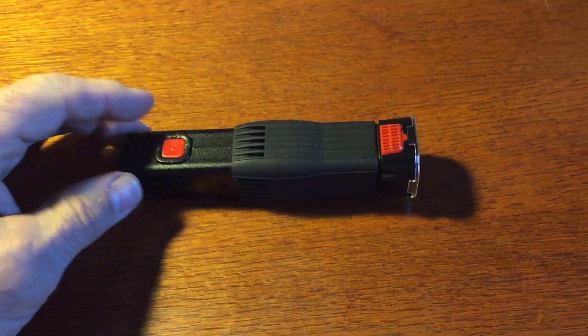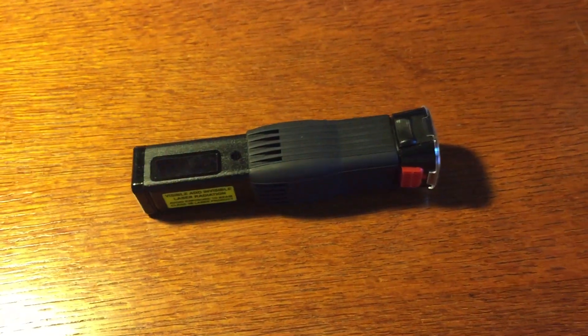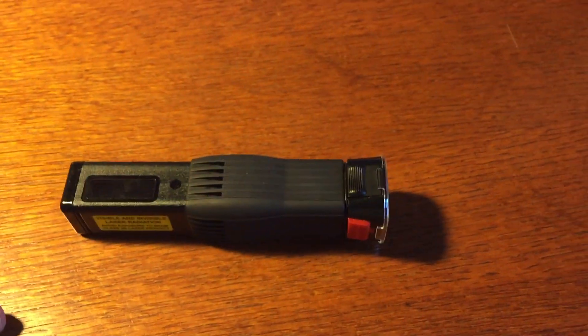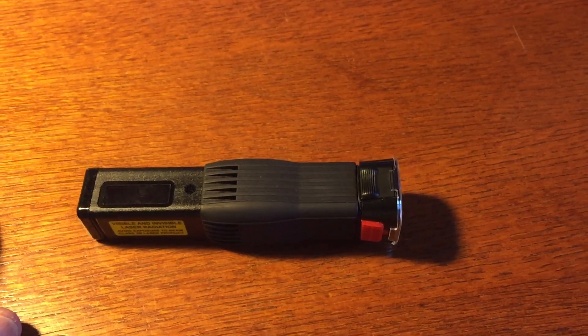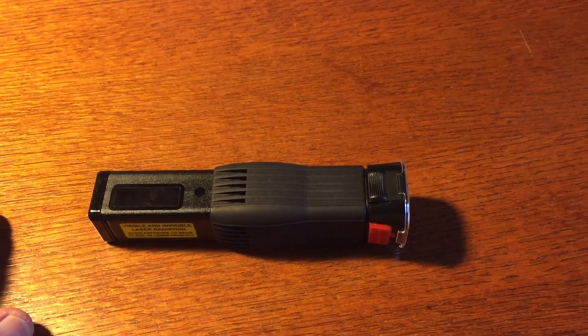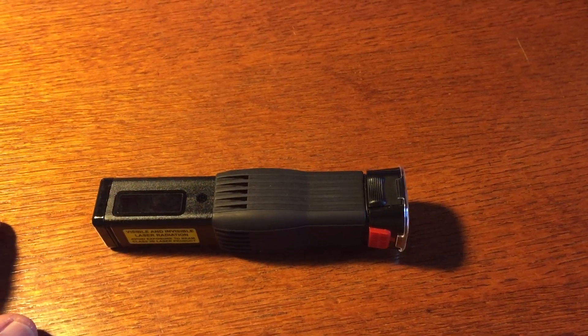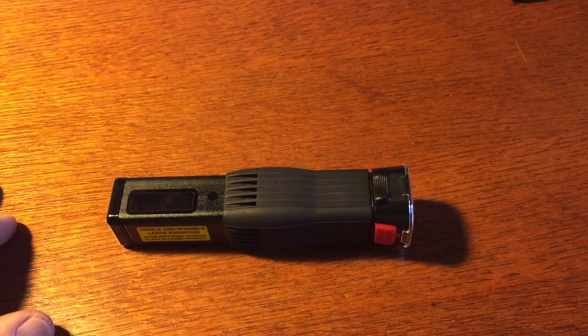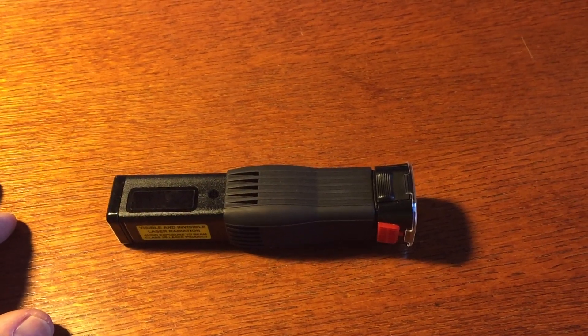This is an amazing instrument — programmed with 1,800 different frequencies. It also allows us to reprogram it through our computer in a matter of seconds. It does everything that we want it to do. We've been using it for five years and now we're using this exclusively for frequency specific low-level laser therapy in the veterinary medical field and also the other field.